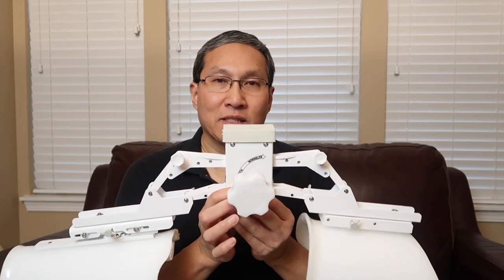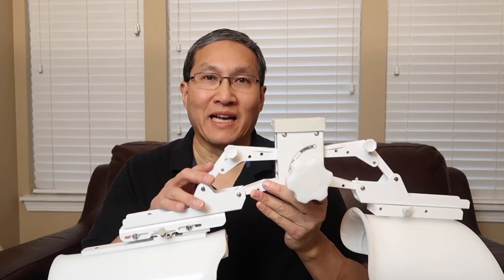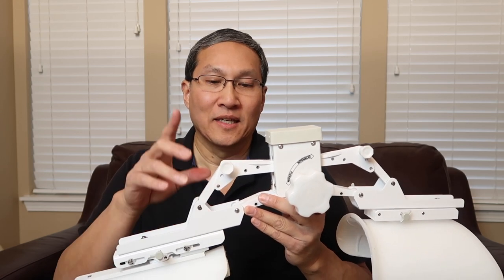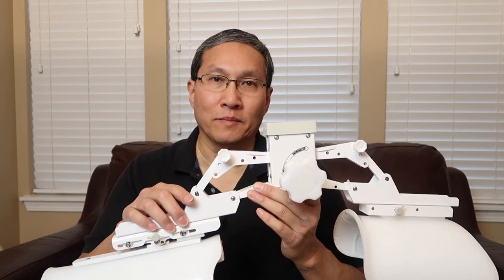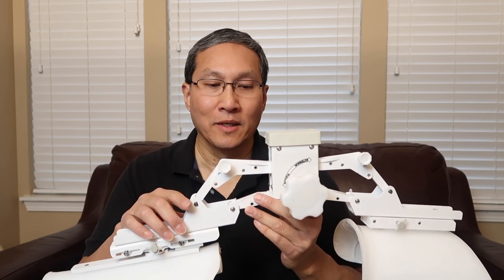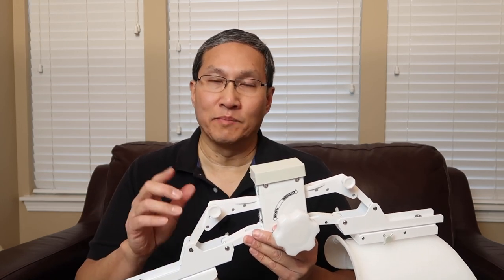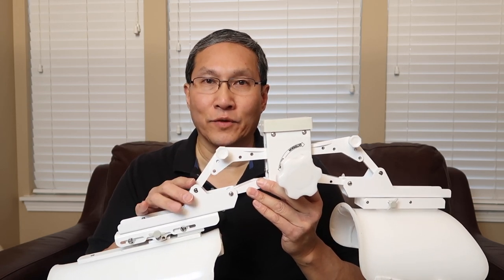Jazz has a couple of different units available. This one is the SPS-1, which is the one they rent out. You know you have an SPS unit if it's made out of metal. You have an Easy unit if it's made out of plastic. I'm going to be talking about the metal one, because the metal one is the one that can convert from extension to flexion and back. The Easy units are made specifically for either extension or flexion, so you'd have two separate units.